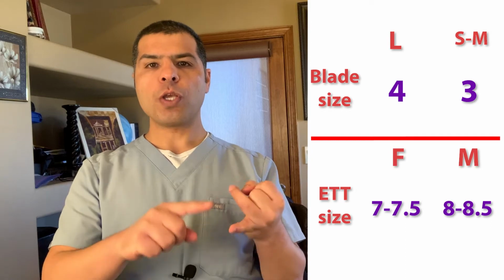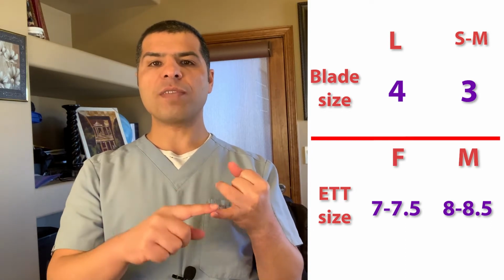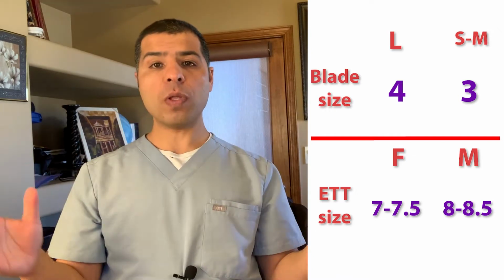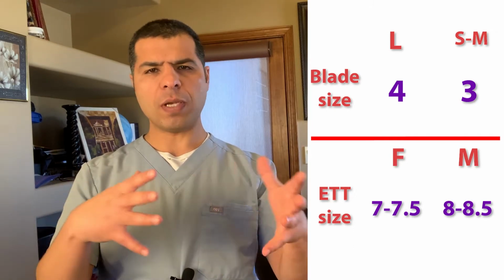Make sure you have an ET tube of a smaller size. Let's say you pick 8. Make sure you have 7.5 and 8.5 just in case you need it. It's right there. If you don't know what is going on, just confused, busy, pick 7.5 millimeter. Usually works for both genders most of the time.